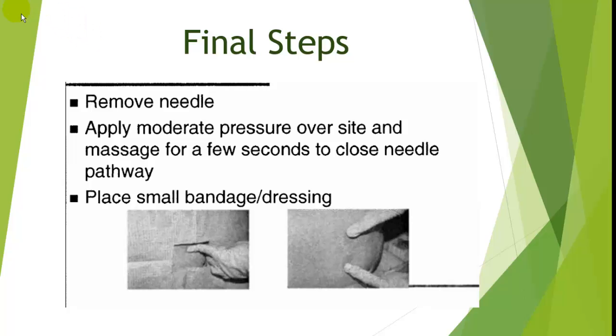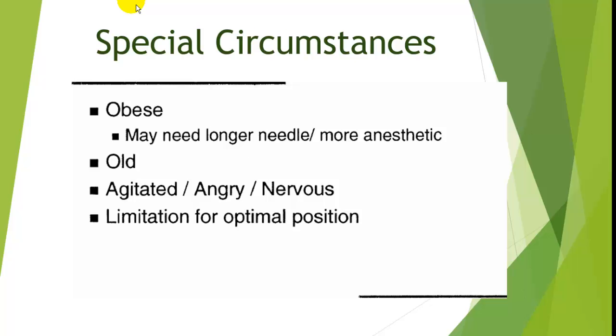After you remove the needle, you put pressure over the site for a few seconds, and then it's always good to put a Band-Aid on the area so that you know you were there, sort of your signature of a successful spinal tap. Congratulations. And so knowing all of these factors, you can go forth again and do perfect spinal taps.